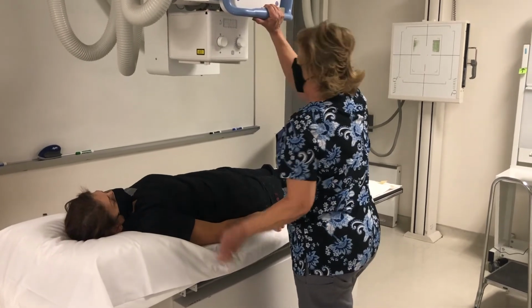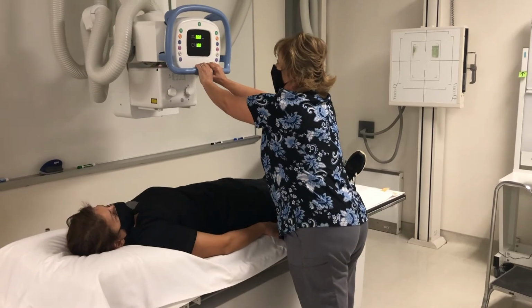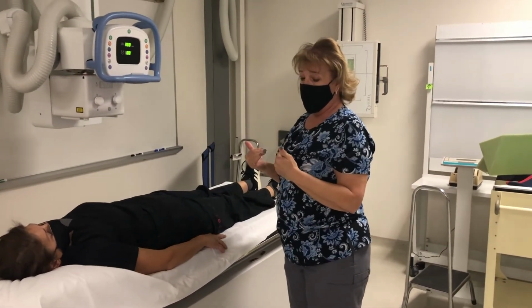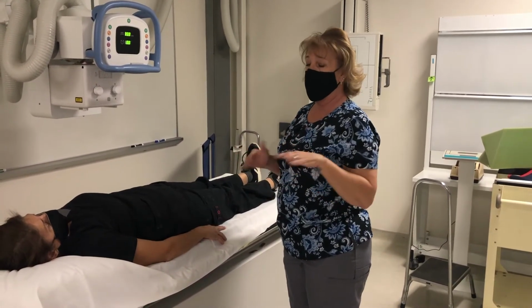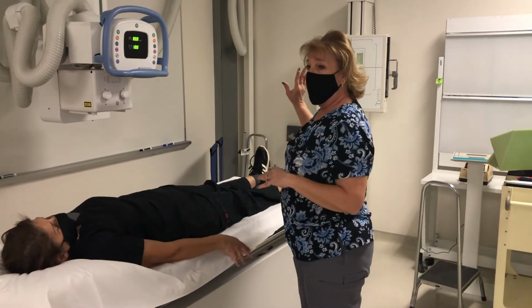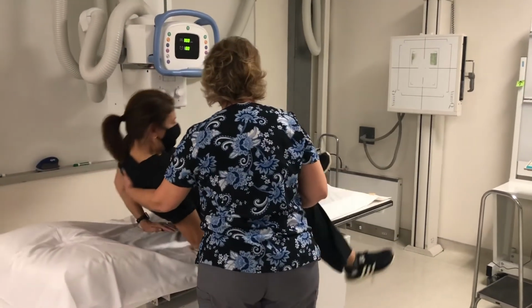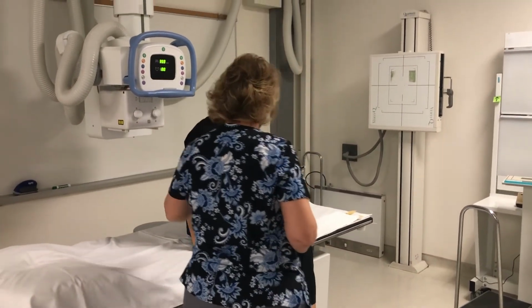And by this point, she's been laying down for possibly 30 minutes. So when you have the patient sit up, make sure that they aren't dizzy. So I'm gonna sit her up and let her just sit on the edge of the table before I let her get up to go to the bathroom. So I'm gonna have you just sit up here for just a moment. Make sure that you're not dizzy.